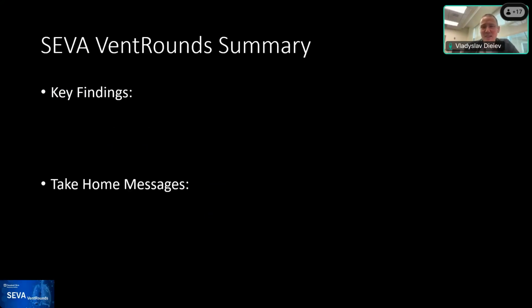Because I think IMV can look very much like CMV, but those nuances in behavior, when you see that your flow is not constant, and in the middle of the breath, just be aware that your machine can be shifting between volume and pressure delivery and dual targeting modes, and that can really affect how you achieve your goals of comfort or safety, and overall the strategy. Perfect. I love that.